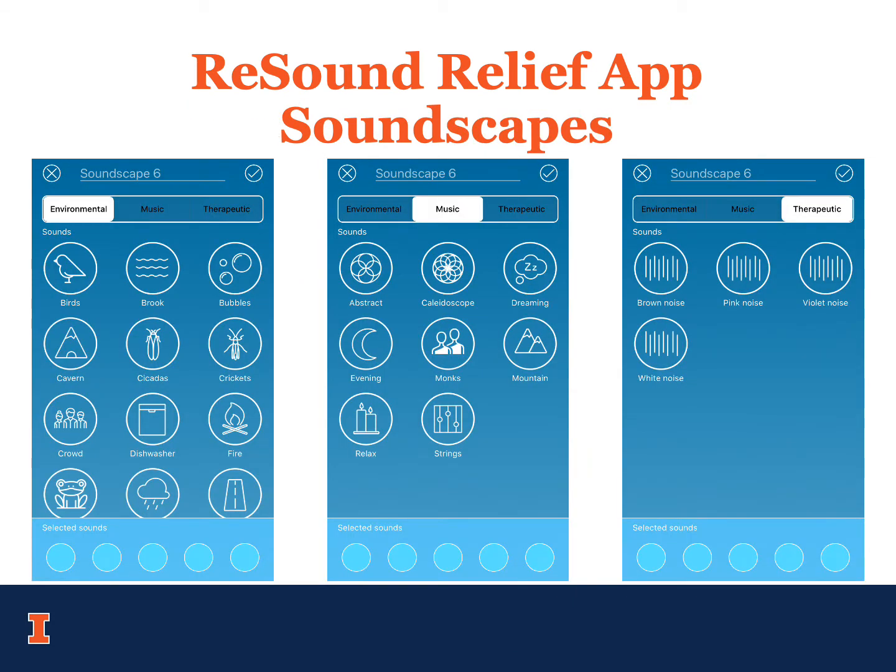Once you hit that plus sign, you can see 3 different categories at the top. You have environmental, which would be anything such as birds, rainfall, thunder, and wind. In the middle, you have music sounds. And then at the very end, you have therapeutic sounds, which would be white noise and pink noise.